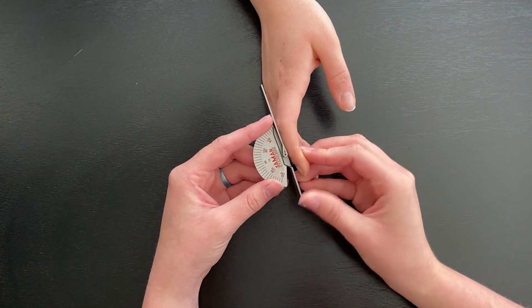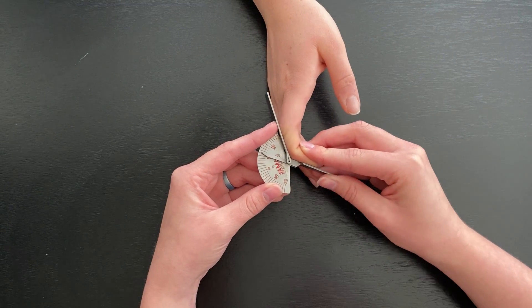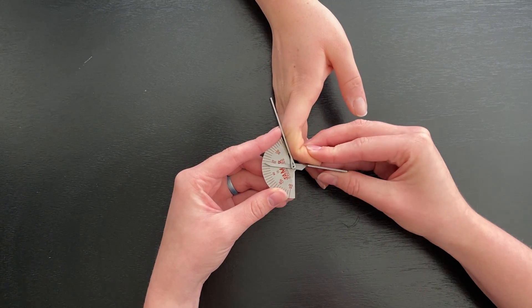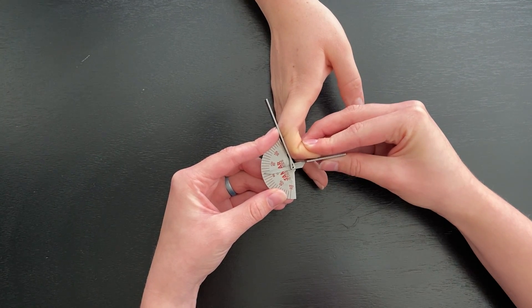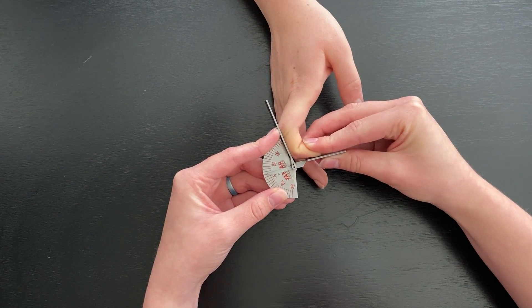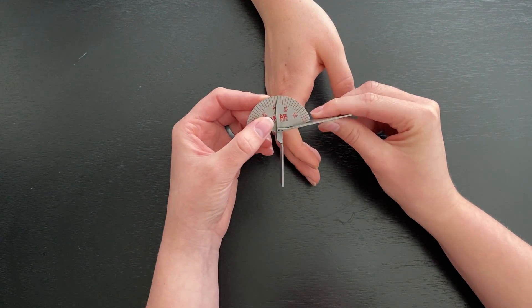So we're going to move her finger to DIP flexion and with this one you really have to be careful with their finger because sometimes that joint doesn't want to bend. Just gently put it into that end feel. Okay and she is at 80 degrees.